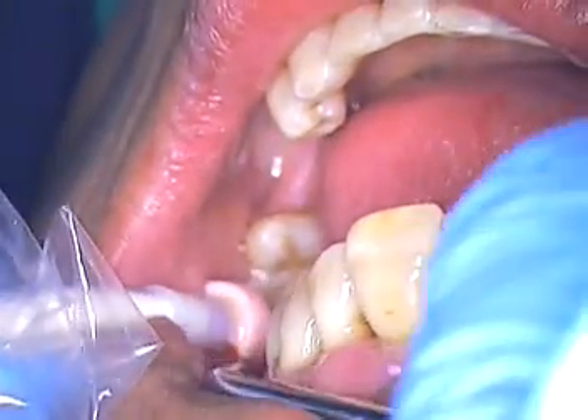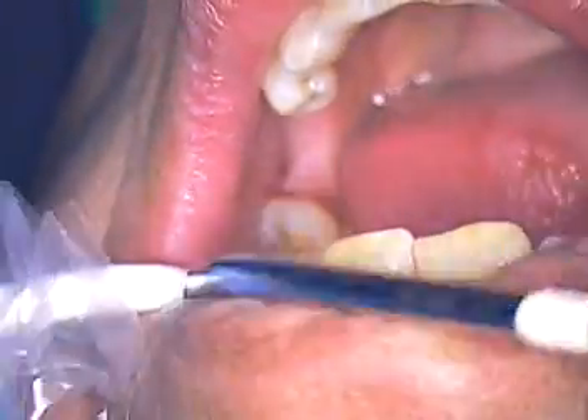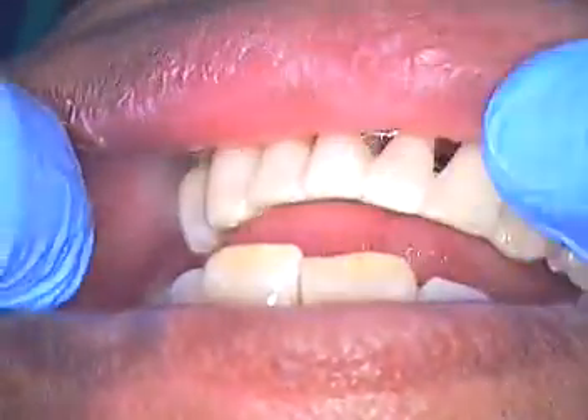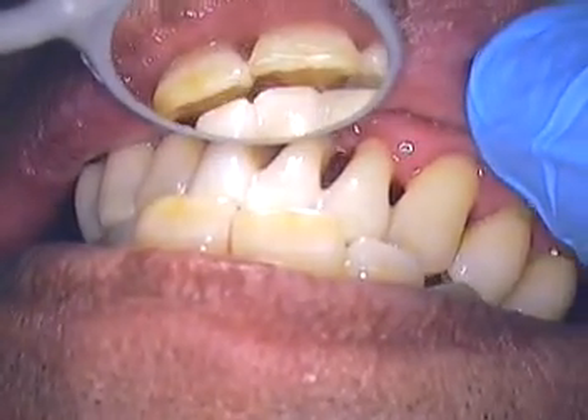Hang in there. We decided to pull — it is off. Have you added that in the jiffy. I'm just going to take a little time and patience, without hurting anything. There we go, it's out. Close down together. Do you feel like you're banging into that tooth at all? It doesn't look like it here.